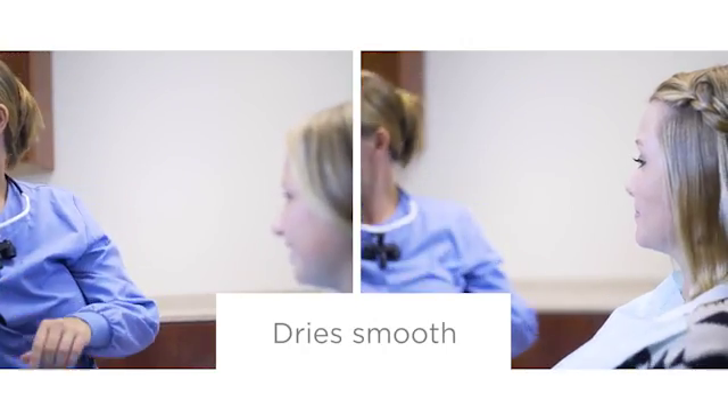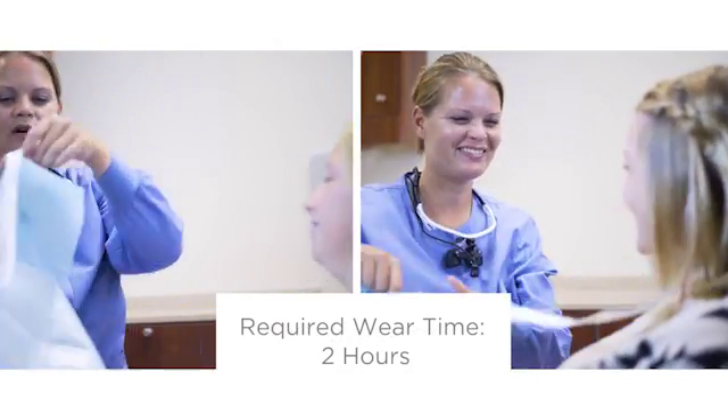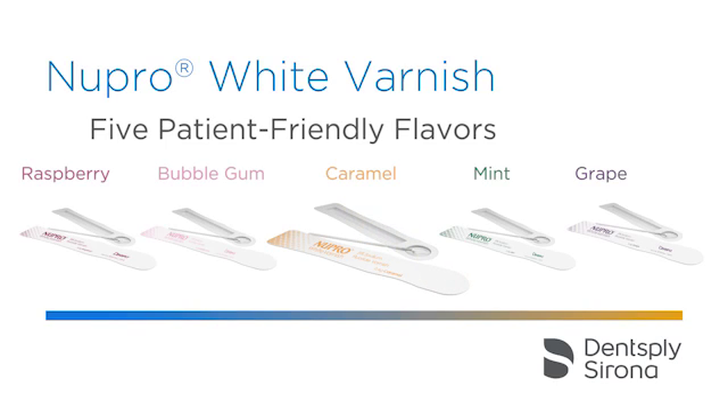Nupro White Varnish is designed to dry to a smooth finish. The required wear time is only two hours, allowing patients to resume normal eating and drinking sooner. Nupro White Varnish delivers more of what you want in a fluoride varnish.